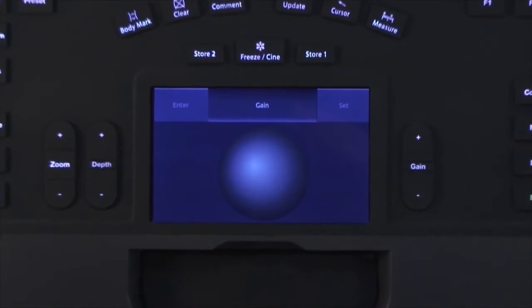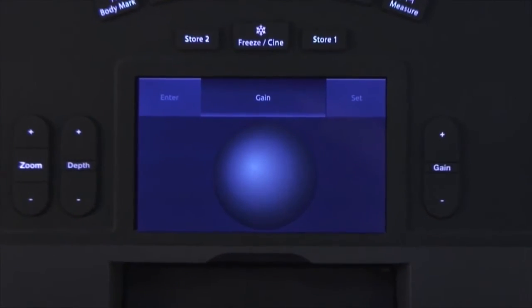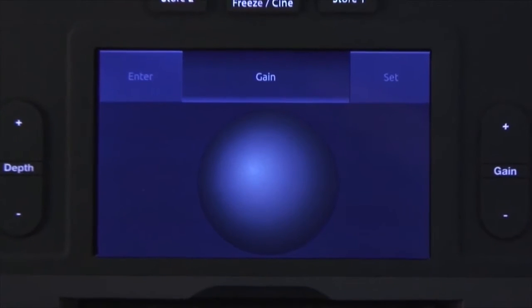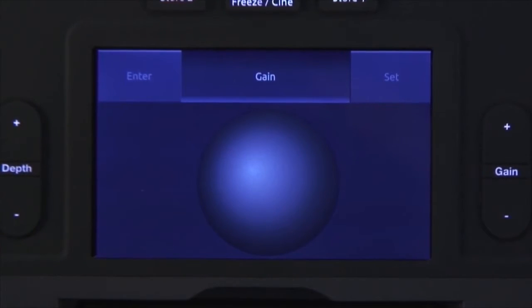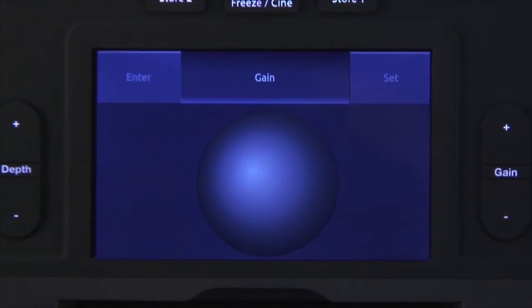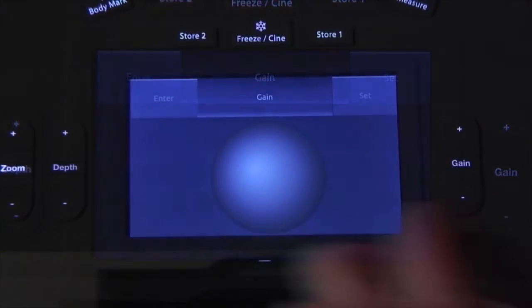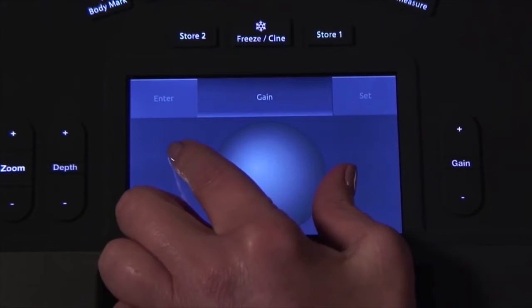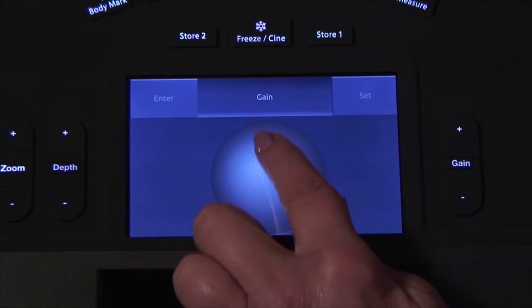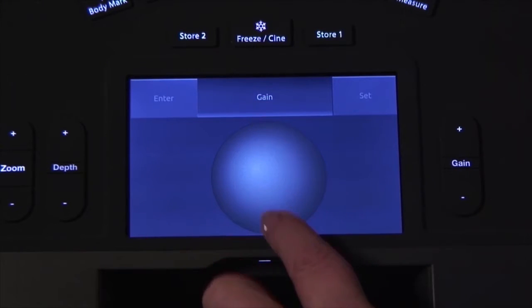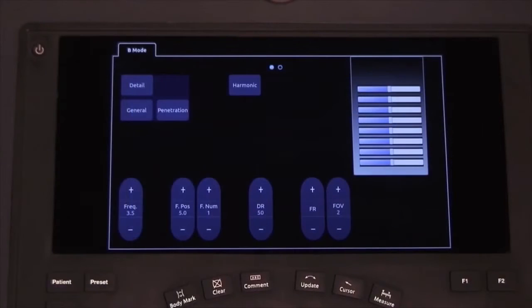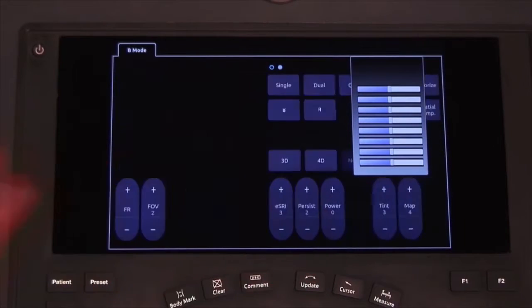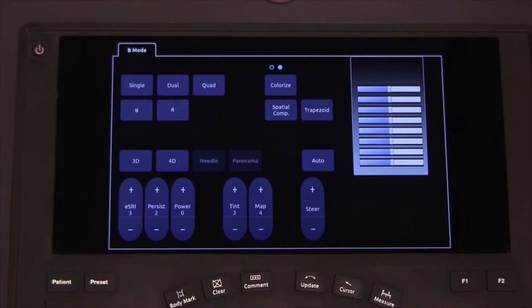The 5-inch touchscreen is a multifunction virtual trackball. Not only does it act as your trackball, but you can swipe across the top to quickly change gain. The multi-touch functionality allows you to zoom the image or resize the color ROI when in color mode.